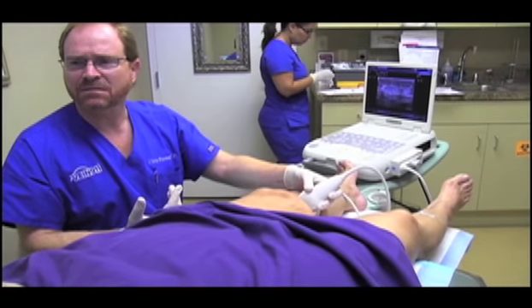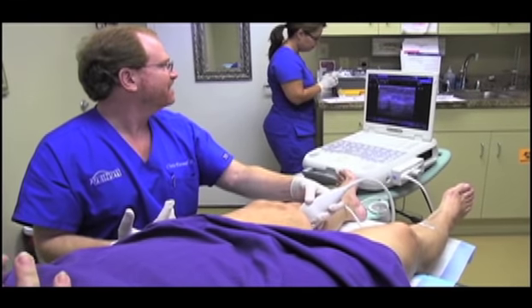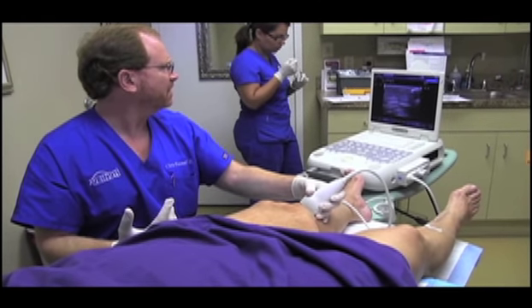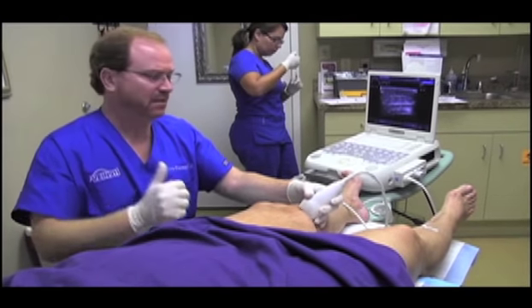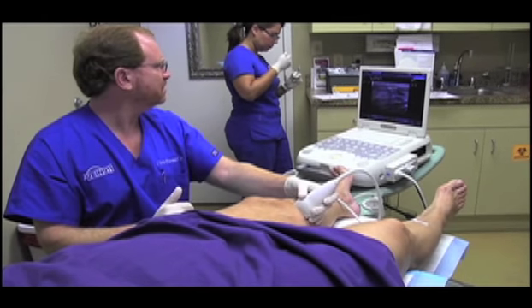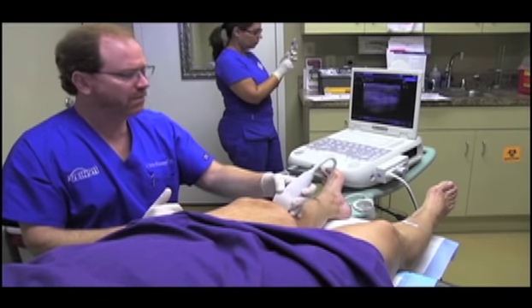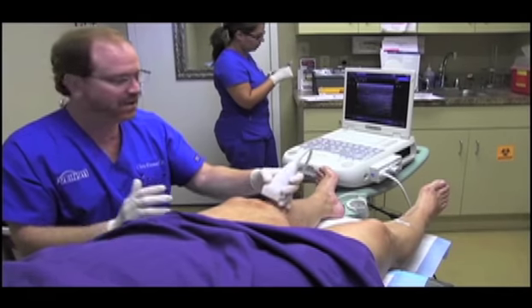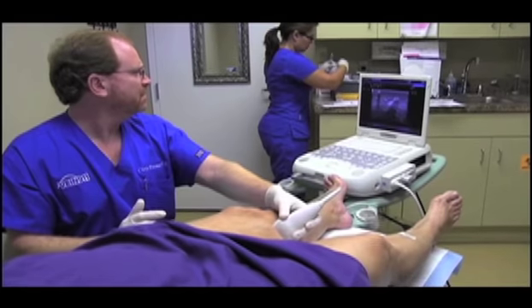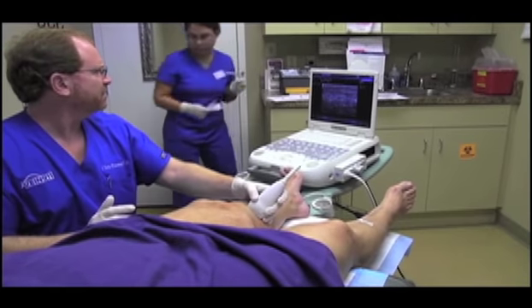You can see she's really doing well. See how well tolerated it is — it's just amazing. We're getting rid of veins today that are this big, and we're doing it without surgery, through a tiny needle. Nobody is yelling or holding hands, and without Valium. If you want Valium, we've got it — but last time she needed it for the laser. Laser can sometimes be a little more stimulating, so some people take that.